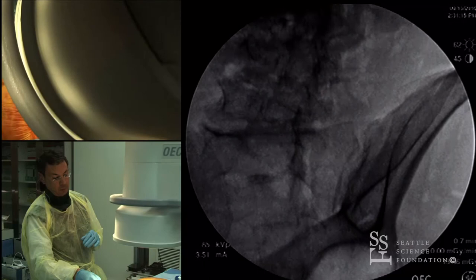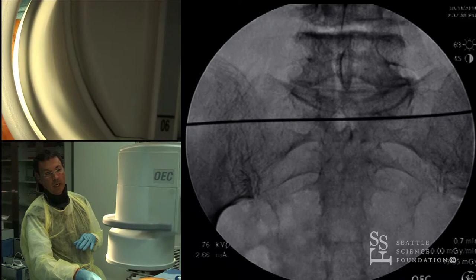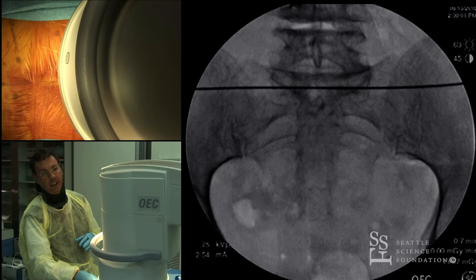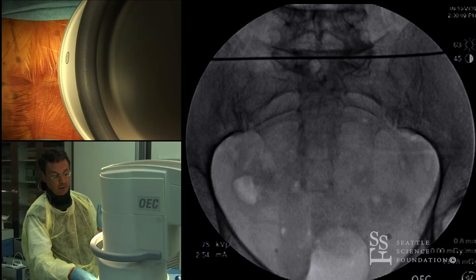The best approach is to use fluoroscopy. On a regular straight AP shot, we want to be at the bottom of the S1 pedicles. Then with five to ten degrees of inlet view, you get an idea of where to make the incision on the skin. You can see that at zero degrees AP you are at the bottom of the S1 pedicle, and at five to ten degrees inlet view you are at the top of the pedicle.